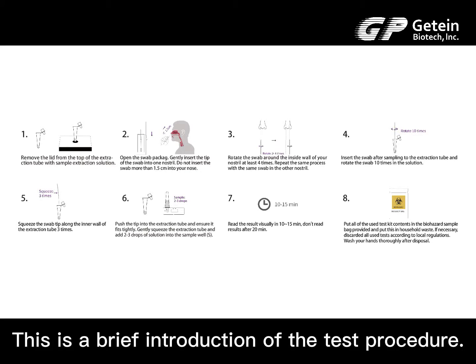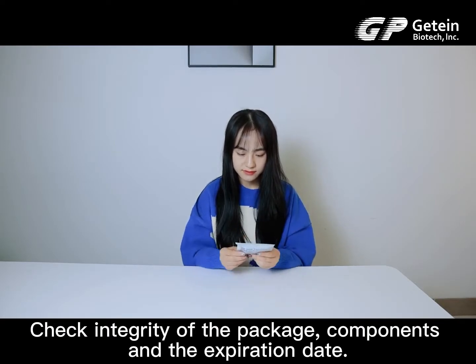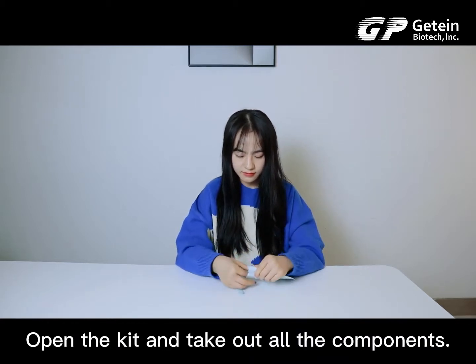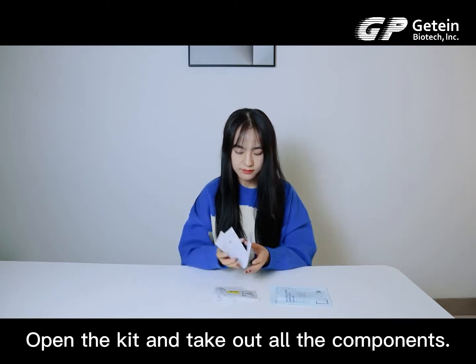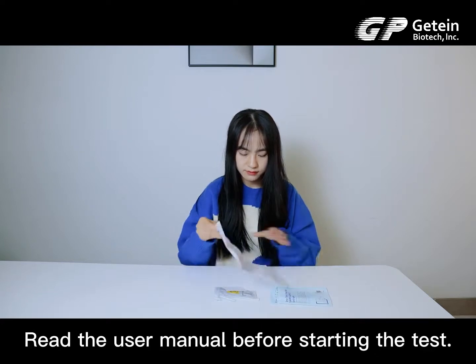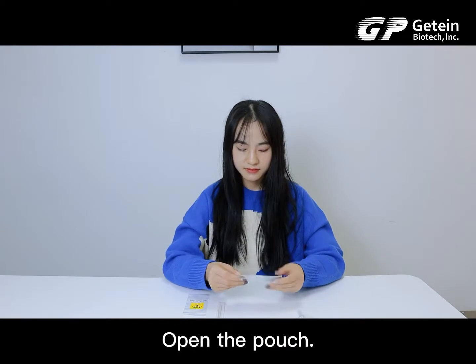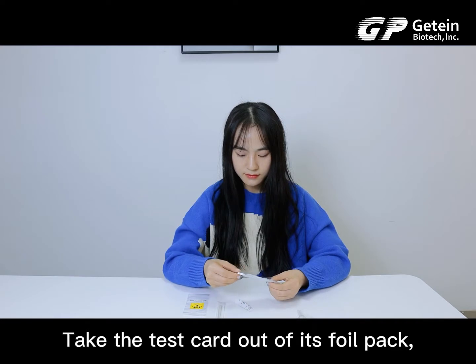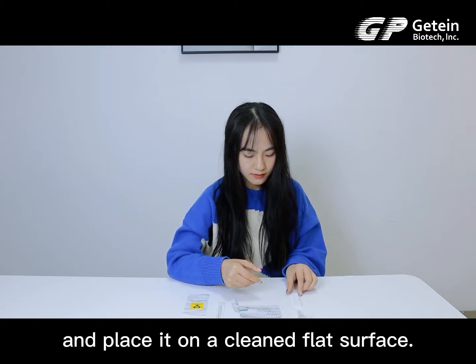This is a brief introduction of the test procedure. Check the integrity of the package, components, and expiration date. Open the kit and take out all the components. Read the user manual before starting the test. Open the pouch. Take the test card out of its foil pack and place it on a clean, flat surface.